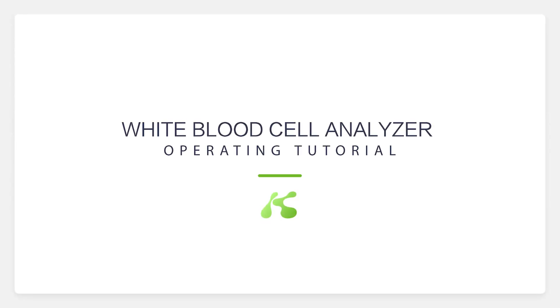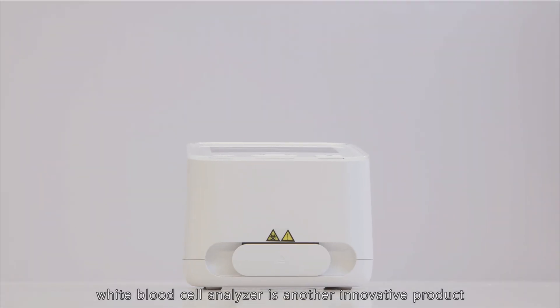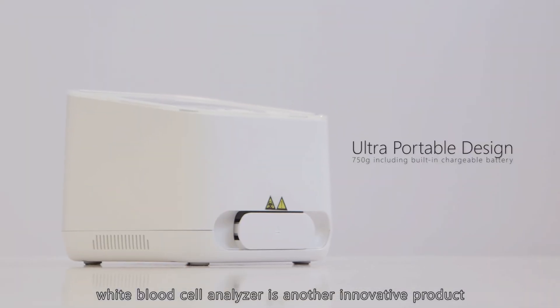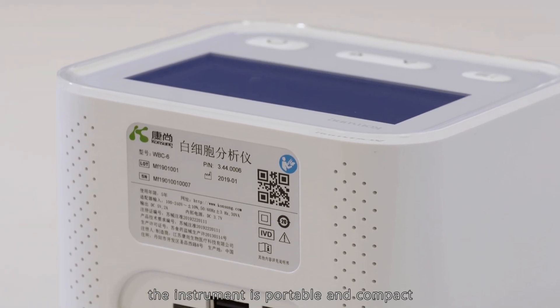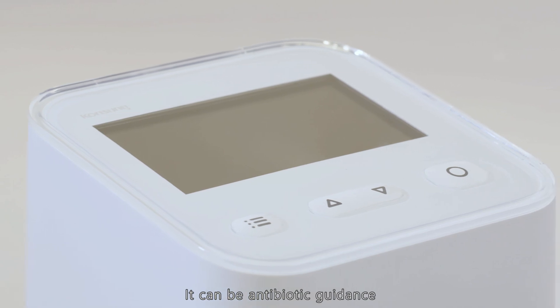Kone Sung always focuses on medical health. The White Blood Cell Analyzer is another innovative product. The instrument is portable and compact, with long-term standby capability. It can be used for antibiotic guidance.